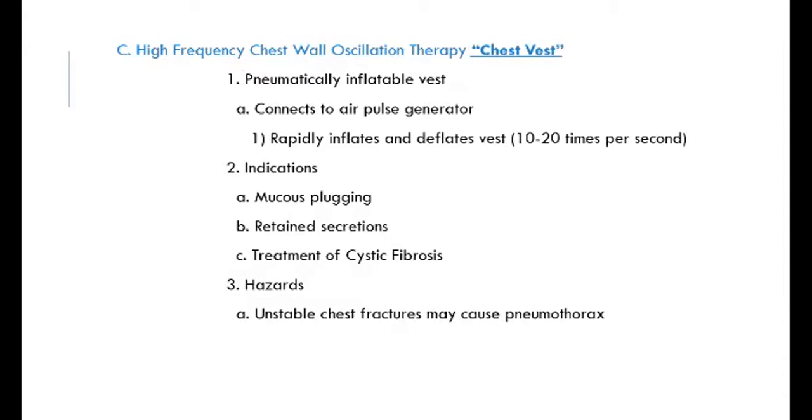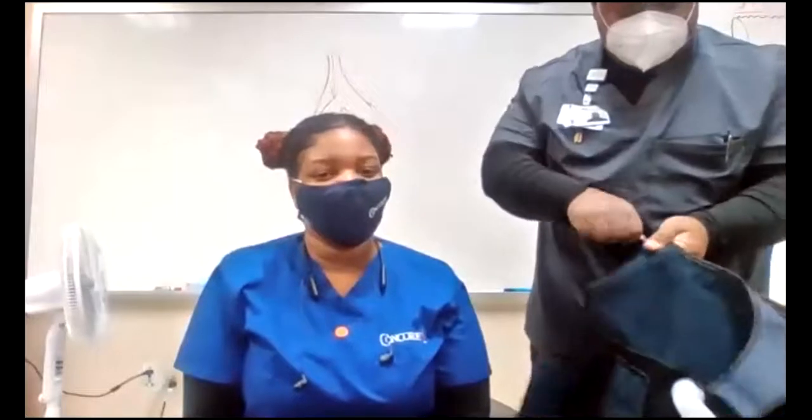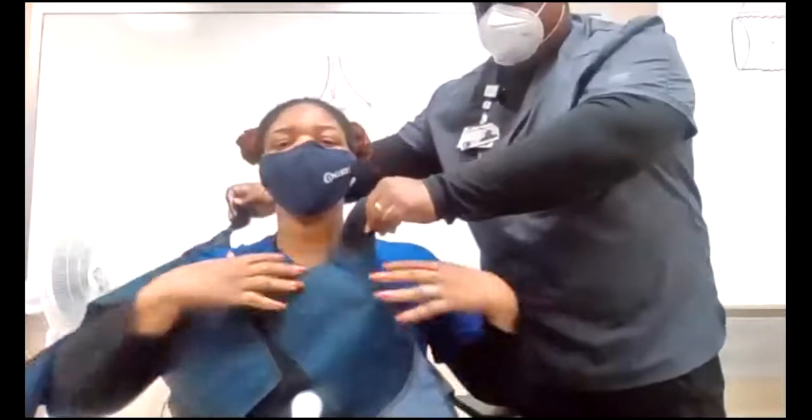So this is the chest vest. I'm going to demonstrate. Volunteer. All right. This is the chest vest. You can sit down in this chair. Be careful because the screw came out. All right. This is the chest vest. Straps up like a bulletproof vest. There you go.